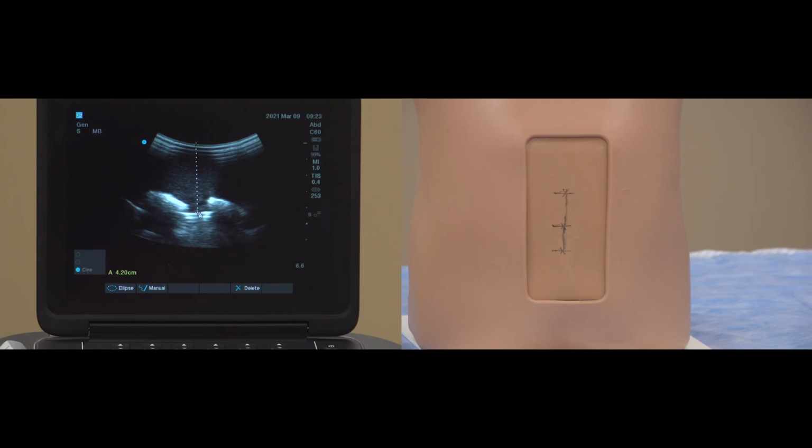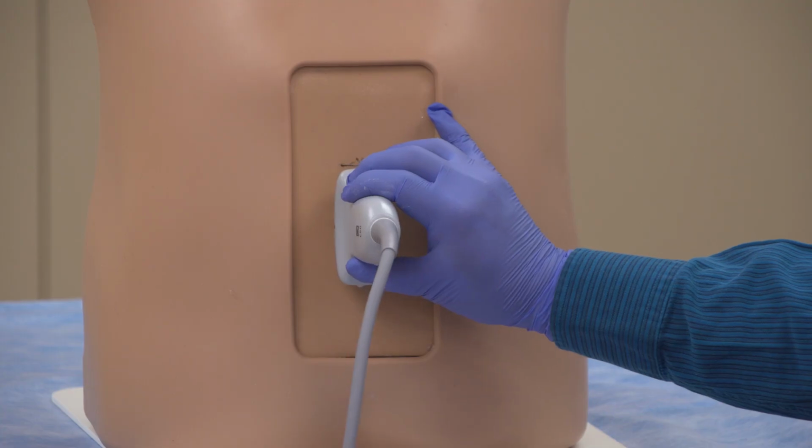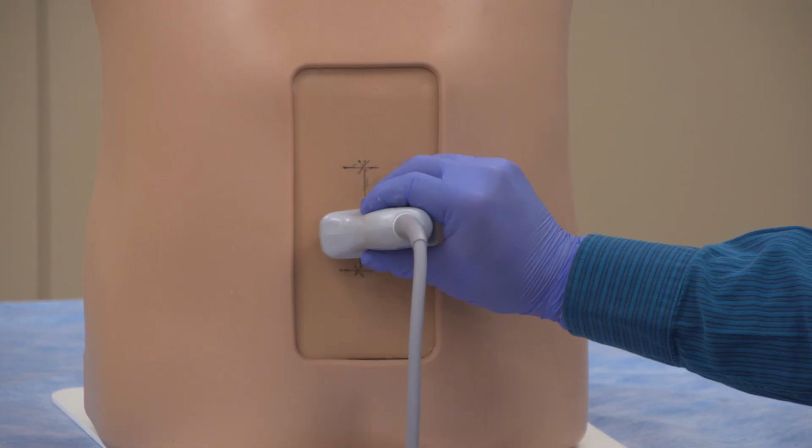And challenges in this approach: sometimes you can't visualize the ligamentum flavum. In that case, you could use the laminal depth as a surrogate rough estimation. A second way to visualize depth is in the transverse axis.